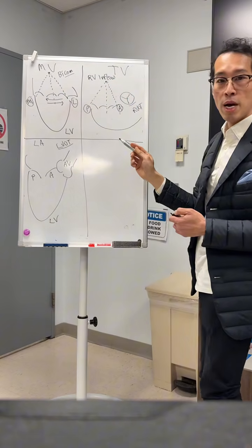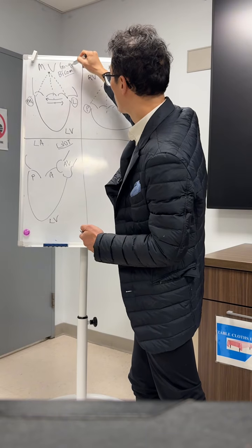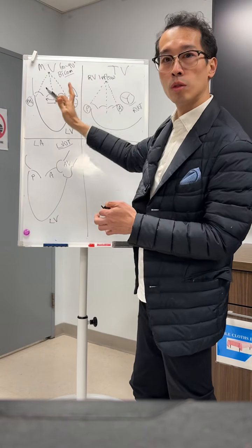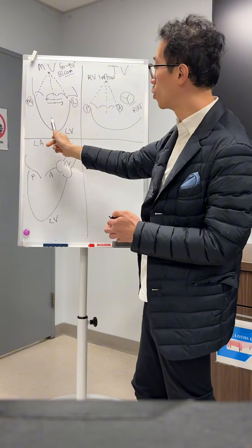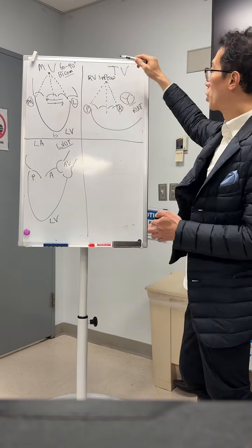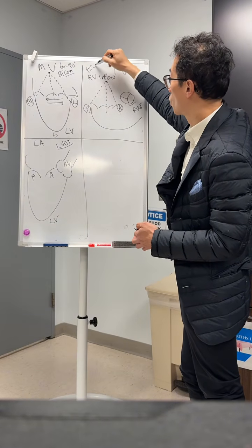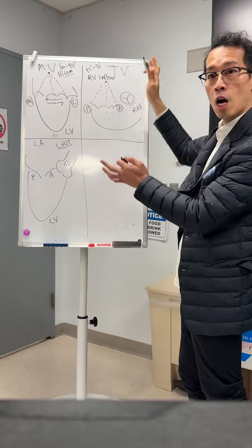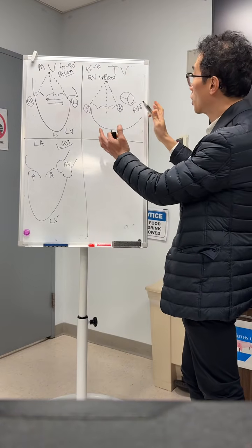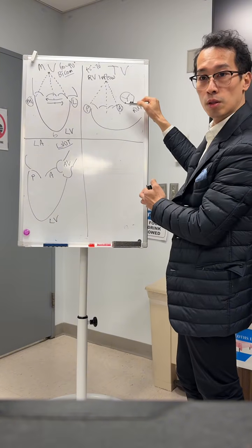Here on the mitral side, typically you will be between 60 to 90 degrees, depending how the heart is rotated, and you want to make sure your apex is 6 o'clock. Here, most of the time people say it's 45 degrees, but actually you might need to go all the way to 70, depending again how rotated the RV is, because you don't want the beam crossing the aortic valve.